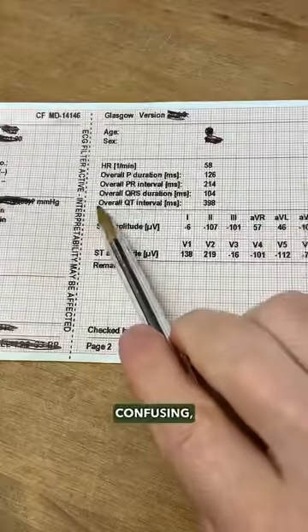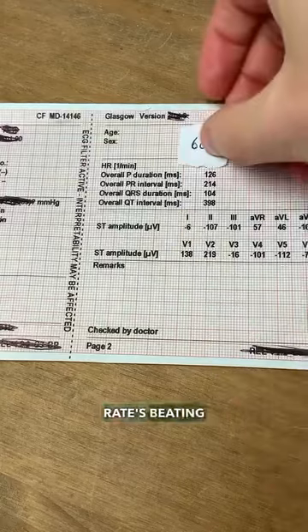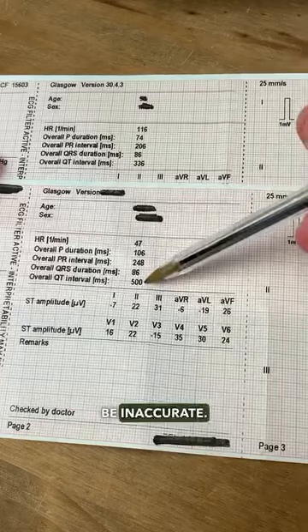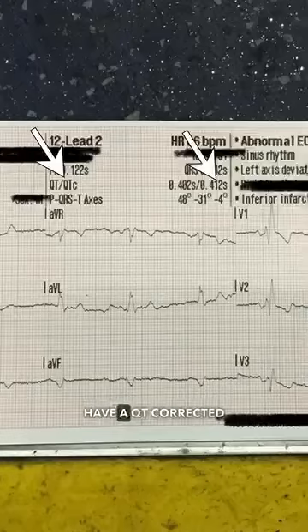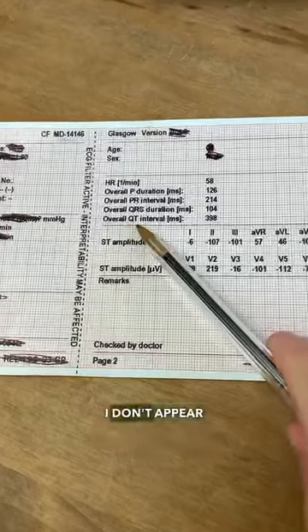To make life more confusing, the overall QT interval is only accurate if the rate's beating at 60 beats per minute. A fast or slow heart rate can cause this to be inaccurate. For this reason, some machines have a QT corrected calculation, which adjusts for the change in rate and provides an accurate reading. But as you can see, I don't appear to have that luxury.